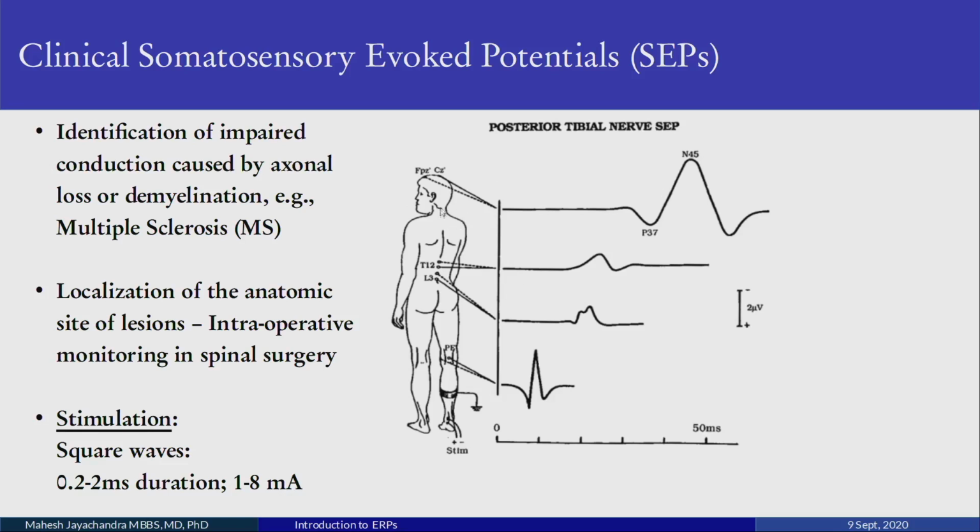So the neurosurgeon is operating somewhere here, typically trying to straighten the spinal cord because people have scoliosis, their spines are bent, or it's bent in front, kyphosis. So you put rods in and pull the bone back and straighten it. In this process, the spinal cord can get damaged. So if we are monitoring this continuously before, during, and after surgery, we can tell the neurosurgeon, hey, stop, because you're doing something which is causing these potentials to go down.